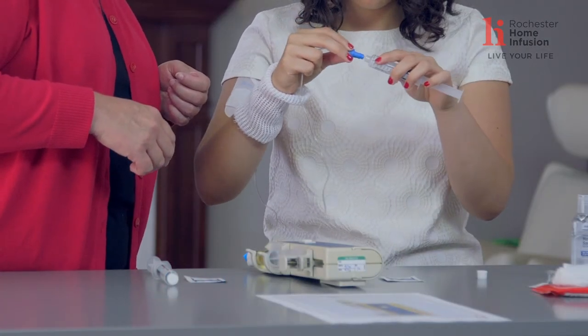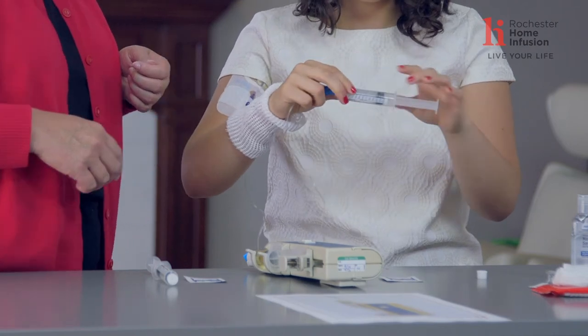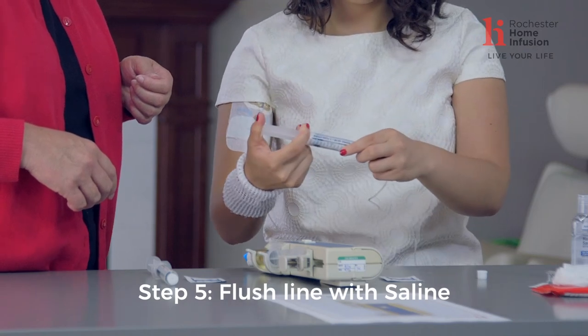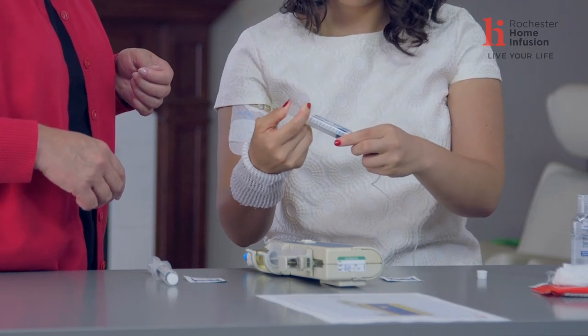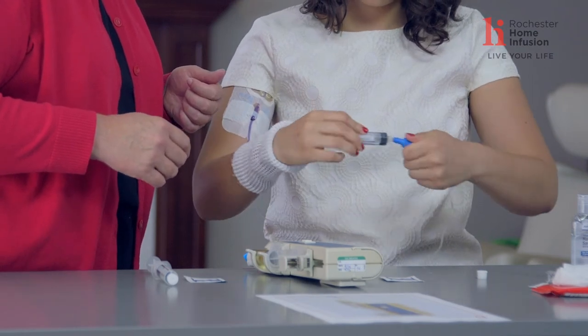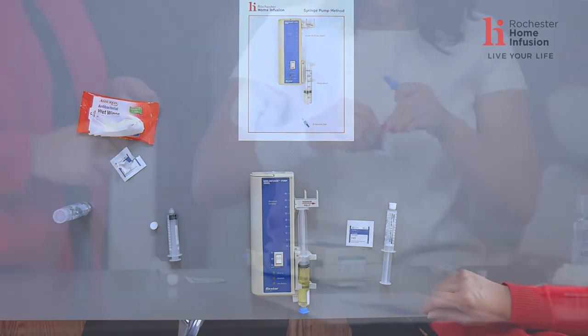Hold that syringe nice and close towards the top, push into your clave, turn it on, and now do your quick and jerky flush. Push it all in as quick as you can, then turn that syringe off and lay it aside. Do one more alcohol wipe before connecting to your syringe — lay it over the end and twist and turn for another 30 seconds.